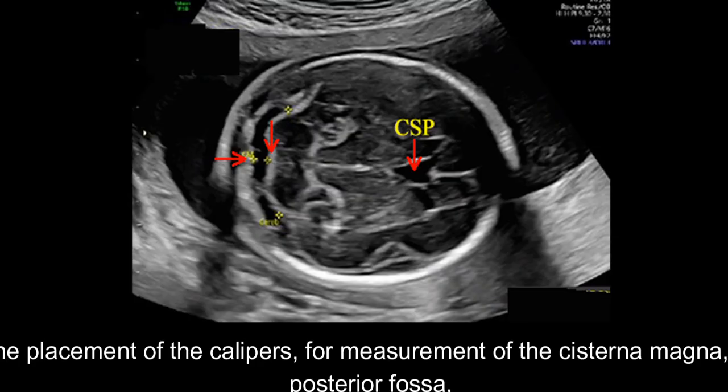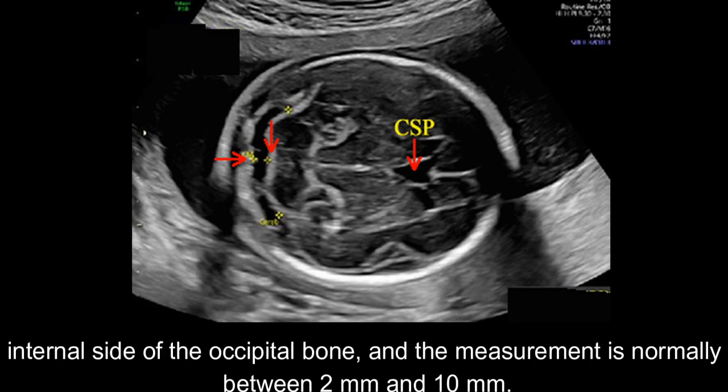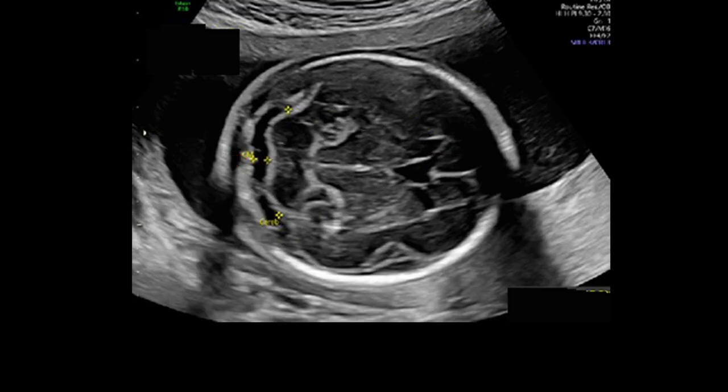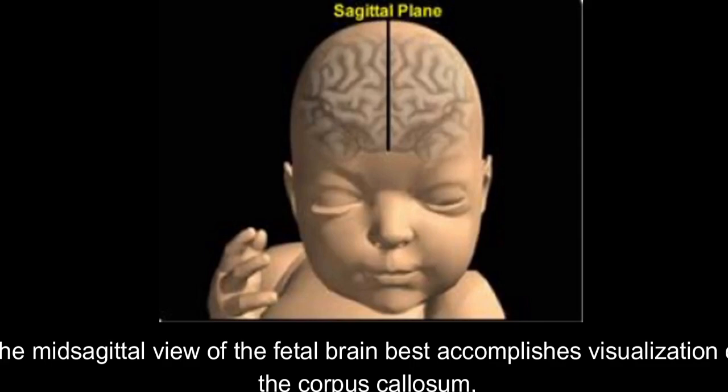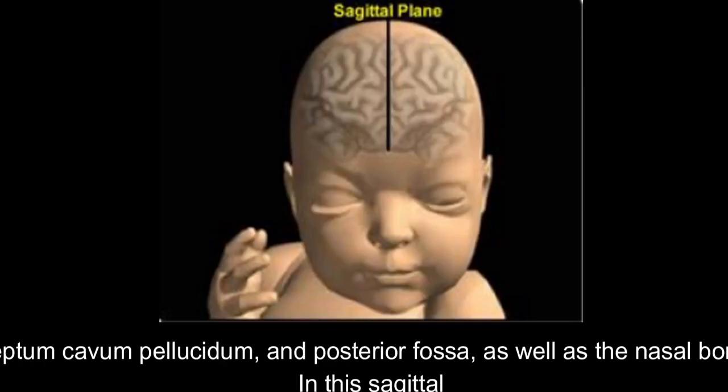The placement of the calipers for measurement of the cisterna magna, or posterior fossa, is illustrated. The calipers are placed from the outer aspect of the cerebellar vermis to the internal side of the occipital bone, and the measurement is normally between 2 mm and 10 mm. The mid-sagittal view of the fetal brain best accomplishes visualization of the corpus callosum, cavum septum pellucidum, and posterior fossa, as well as the nasal bone.